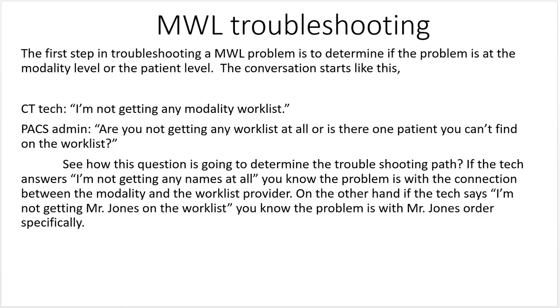So the first step in troubleshooting a modality worklist problem is to determine if the problem is at the modality level or the patient level. And the conversation starts like this. The CT tech might say, I'm not getting any modality worklist. And the PACS admin might say, are you not getting any worklist at all? Or is there one patient you can't find on the worklist?